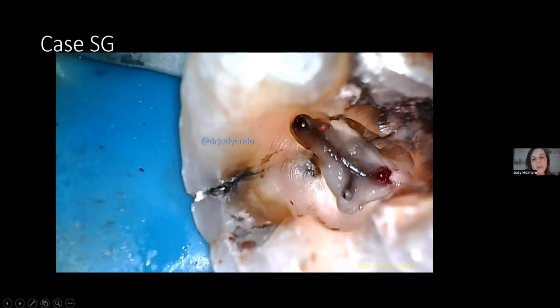The other thing that I'm doing, again, you saw, is sealing over with flowable. And in these cases, I'm reducing the occlusion. And when the referring dentist allows me, I'm also building up the crown, the core myself. I'm doing the cores in my office so that they have less risk, right? They leave my office, they're numb, they go to chew, heaven forbid, even though I tell them not to, and they bite down on one thing and then the tooth has to come out. That's what I don't want to happen. So when I can, when I have permission, I'm also doing the core.